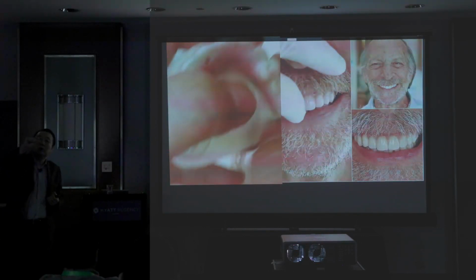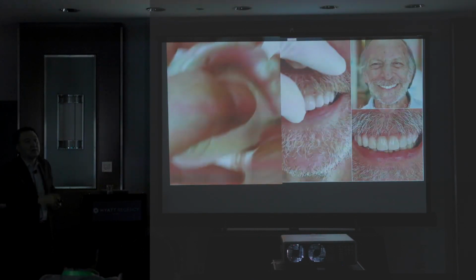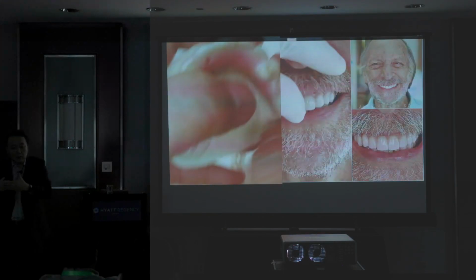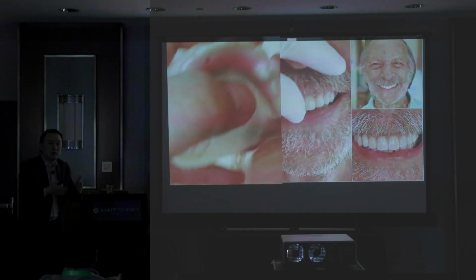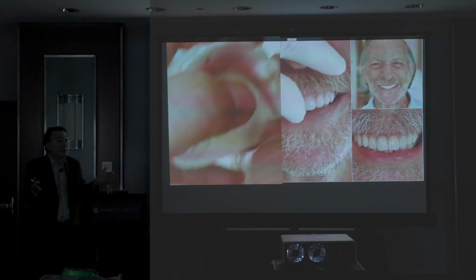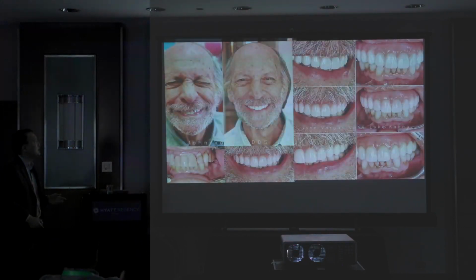They place the implant in the subgingival area, 6, 7, and then on parallel implants is the failing, right? Or the Ti base is small and the zirconia is this much. Occlusion hitting, Ti base failing. They keep complaining about the cementation, possible human error. Maybe my technician did not follow what the cement company said. Maybe my employee is upset with me. Maybe he screwed up. Everything is possible. But most likely the problem is the Ti base, that's why I corrected it.